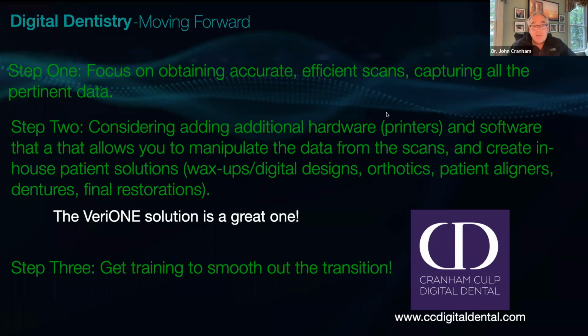Now the tip is, I don't know if I mentioned it, but I tend to use one cord but bigger. We used to put the 00 cord and then the 0 on top. It's not uncommon for me to put a 1 0 or maybe even a 1, because what I'm trying to do is get the tissue away from the margins, so there's nothing hanging over.